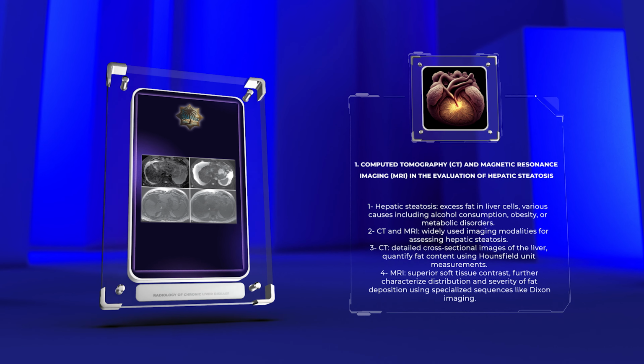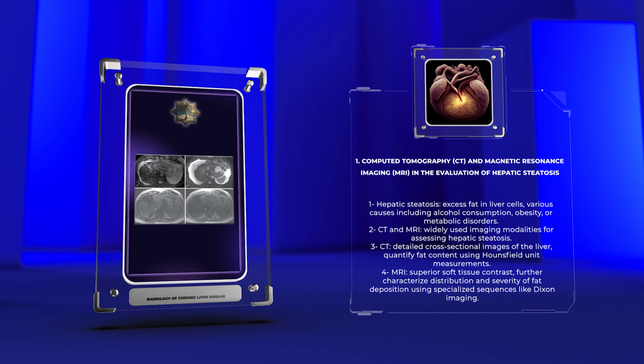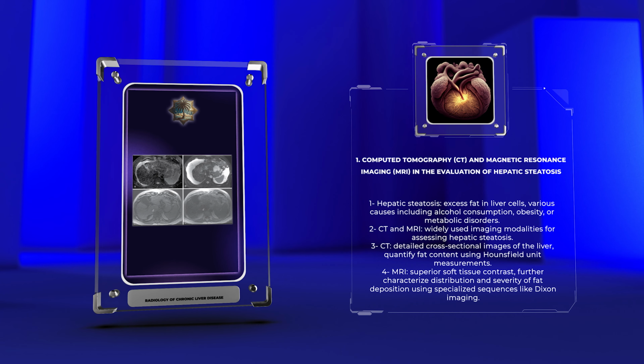MRI, on the other hand, offers superior soft tissue contrast and can further characterize the distribution and severity of fat deposition using specialized sequences like Dixon imaging. These imaging techniques play a crucial role in diagnosing and monitoring hepatic steatosis.